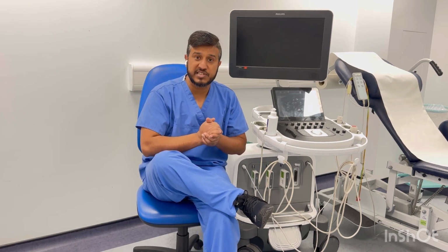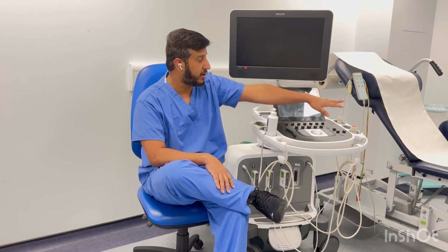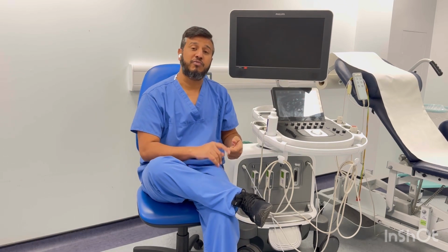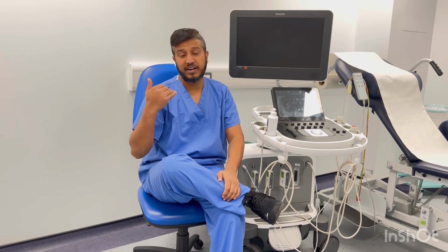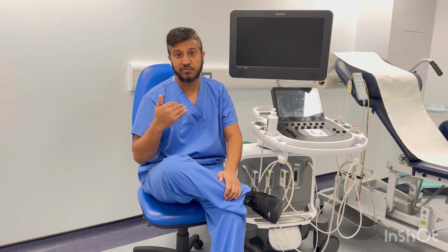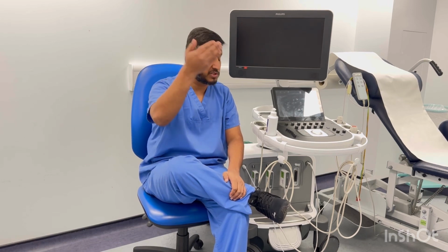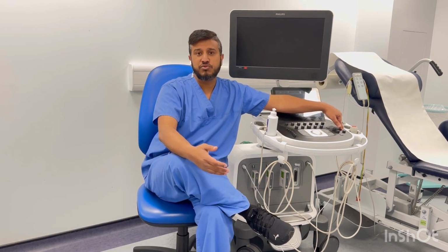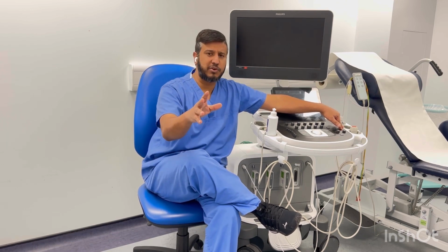So let's take the physics out of it and come into the clinical. You are here in the echo room, the patient is here, and now you need to scan. For the pediatric patient, you are going to use a higher frequency probe. For adult patients, you are going to use a lower frequency probe, and for infants, you are going to use a very high frequency probe, even higher than the pediatric ones. For adults, you are going to use roughly 2 to 3 to 5 megahertz probes.